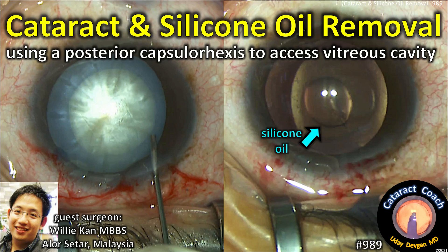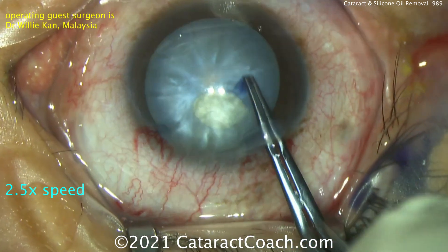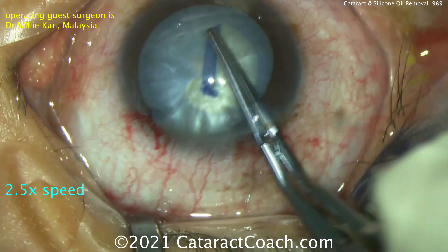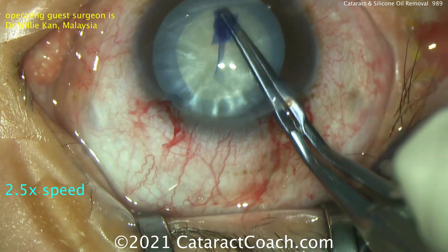CataractCoach.com. We've got a cataract surgery and silicon oil removal using a posterior capsulorhexis to access the vitreous cavity. Our guest surgeon is Dr. Willie Kan from Malaysia. You can see this patient has a white cataract. The patient had a previous pars plana vitrectomy for tractional diabetic retinal detachment, which was repaired successfully, and silicon oil was placed inside the eye.